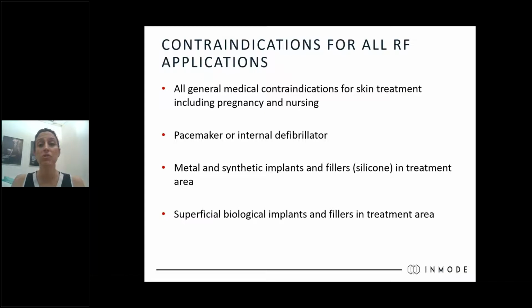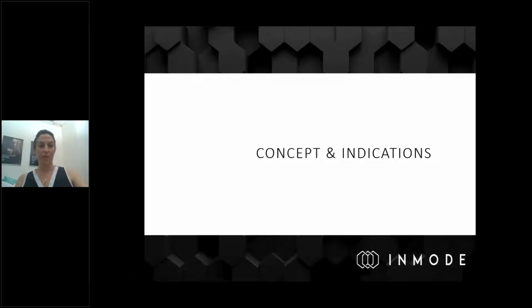If you're looking to combine treatments, then I recommend give the RF treatment, then inject fillers. And that's it about the contraindication and the fillers and RF. Okay, so read through it, make sure your patients are aware of the contraindications and that they sign the form.